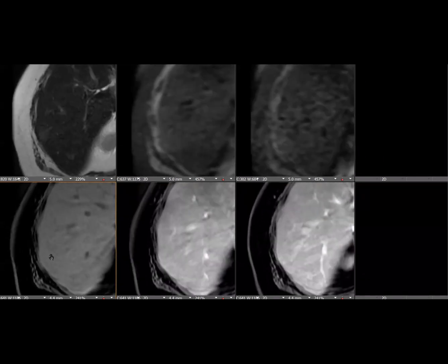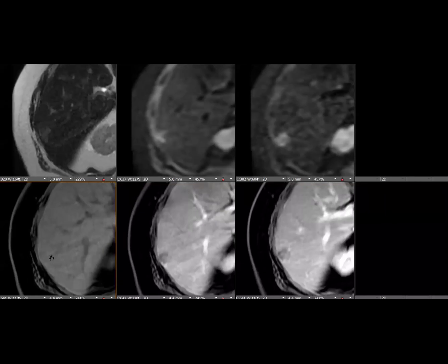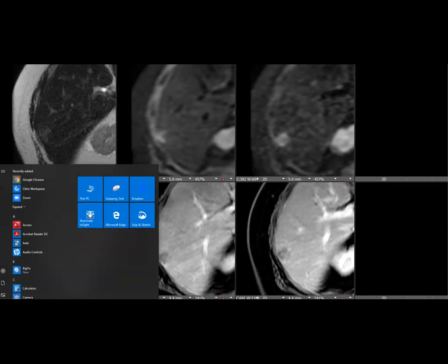So when I saw this, I was like, oh, cholangio. Yeah. Right. You'd say cholangio, and you could be looking at a met. Right. I mean, everything just screams badness.